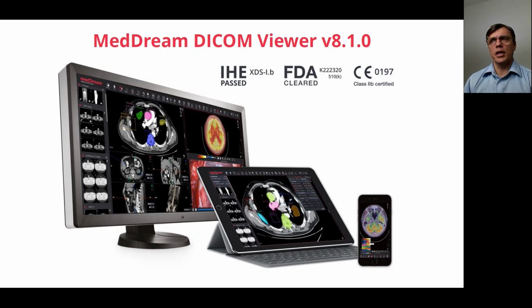It took us several years to come to that place, and it was huge work, not only from the technical part but also from the documentation part, to prepare everything for FDA clearance. So now our product has both CE and FDA clearances, and we are very proud of that. I hope especially our USA partners will really benefit from this certification change in version 8.1.